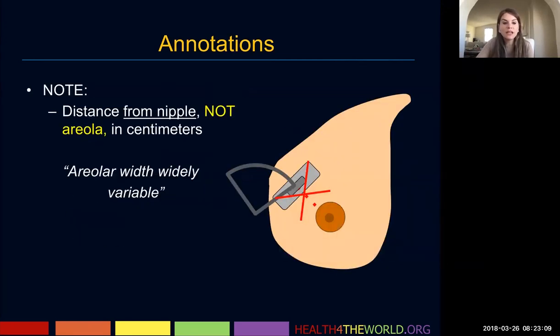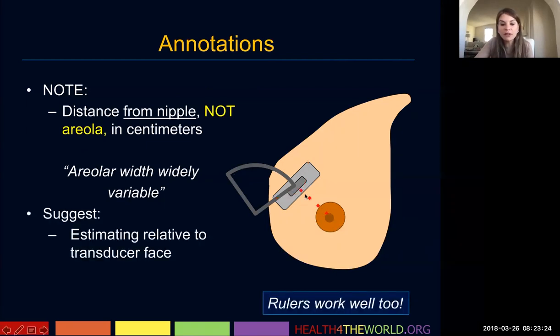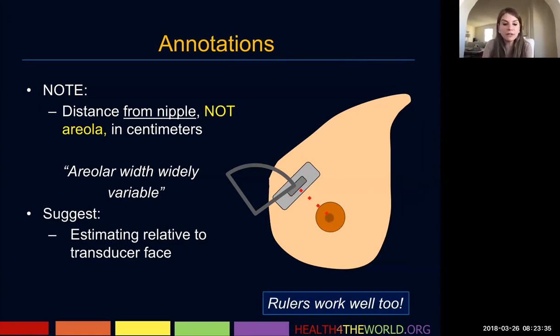When we document the distance of a lesion, it's from the nipple, not the areola. As shown in this graphic representation, documenting from the areola would be incorrect. We want to document from the nipple, because the areola width can be widely variable. You always want to document the distance of a lesion or your ultrasound image from the nipple.